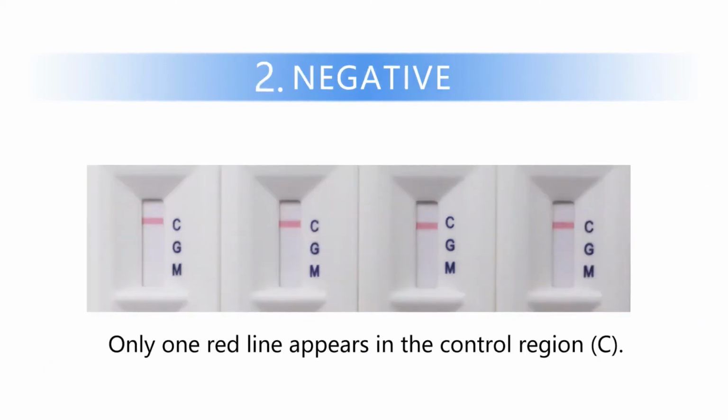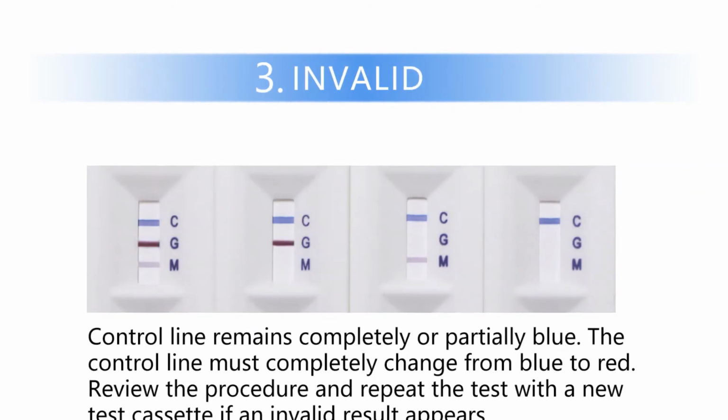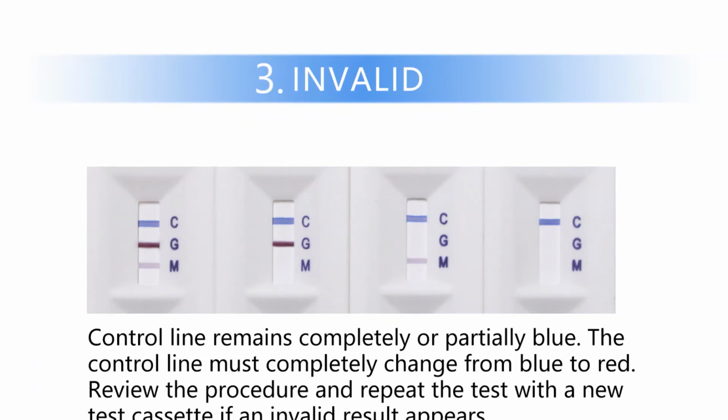Negative. Only 1 red line appears in the control region. Invalid. The control line remains completely or partially blue. The control line must completely change from blue to red. Review the procedure and repeat the test with a new test cassette if an invalid result appears.